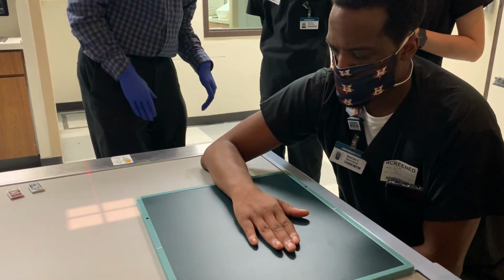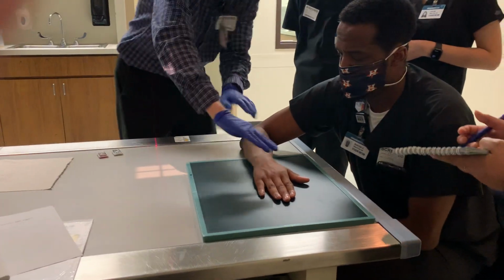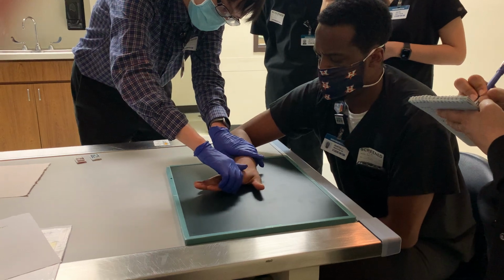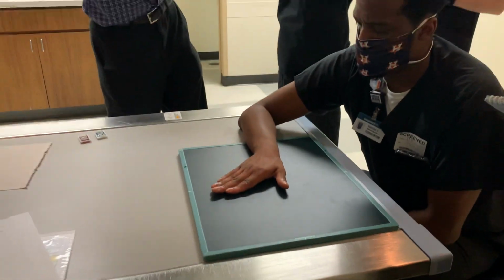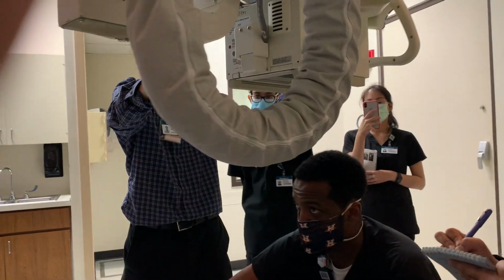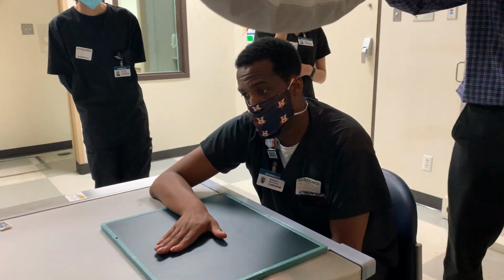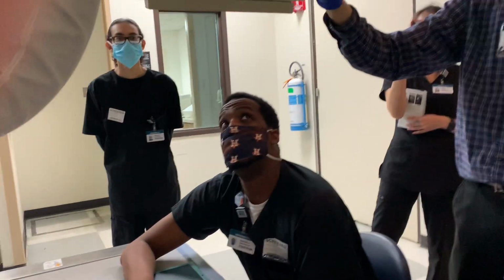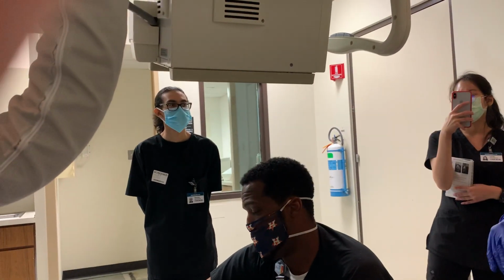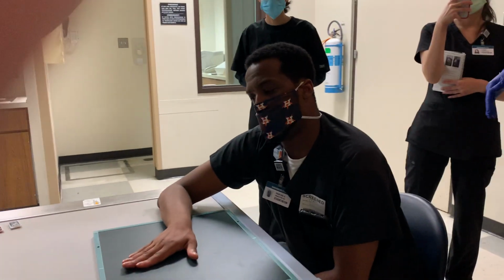So let's say if you did this with the arm bent, and then you did your ulnar deviation, now you would need to take this tube, careful, try not to hit anyone in the face, and you have to angle it this way, right towards the elbow. However you would like to do it, whether straight arm or bent arm, you're angling the tube towards that elbow.